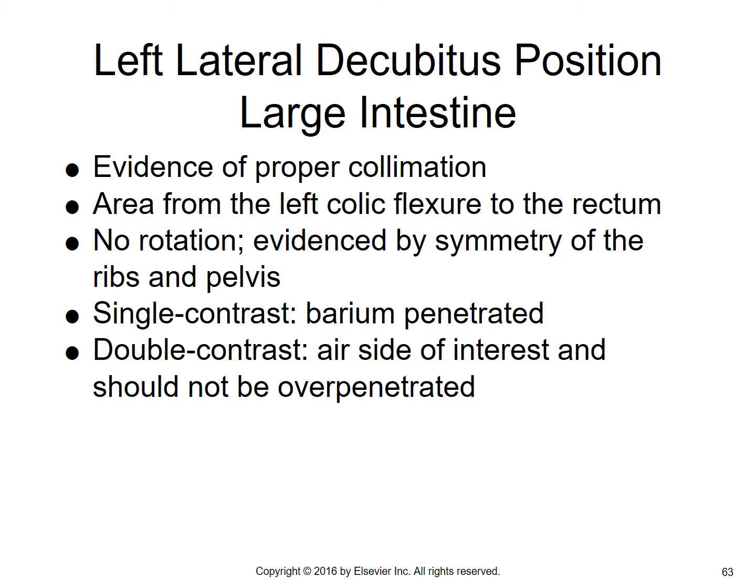Left lateral decube, once again, evidence of proper collimation. Area from left colic flexure to the rectum. No rotation, evidenced by symmetry of the ribs and the pelvis. Single contrast, barium penetrated, and double contrast, make sure you don't over-penetrate that air.